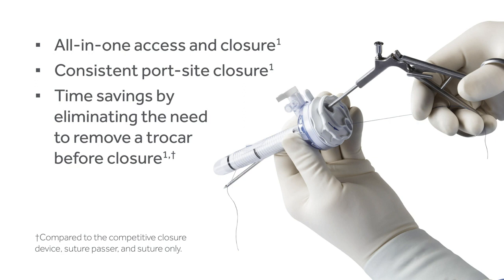The VersaOne Fascial Closure System is a multifunctional tool that serves as a Trocar and a fascial closure device. It gives you all-in-one access and closure, consistent port site closure, and time savings by eliminating the need to remove a Trocar before closure.